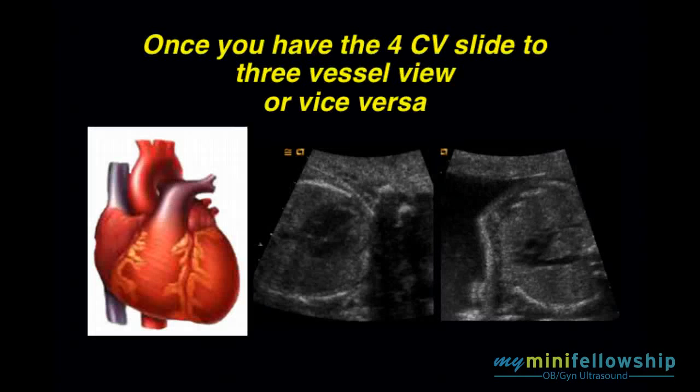So, again, I can't overstress this fact. The fetus is not examined from a printed list. You take the opportunities as they present themselves. So, you get a good four-chamber heart. You're ecstatic. This is the time to immediately grab your three-vessel view.